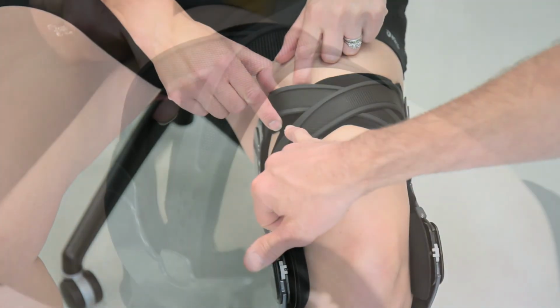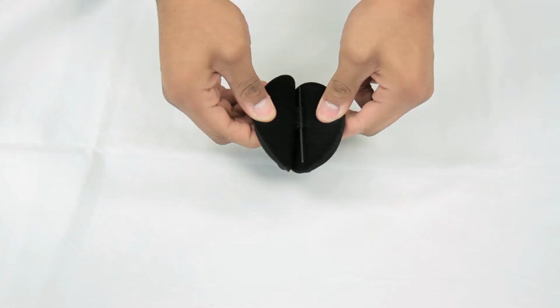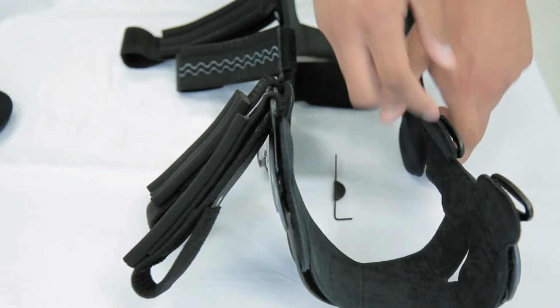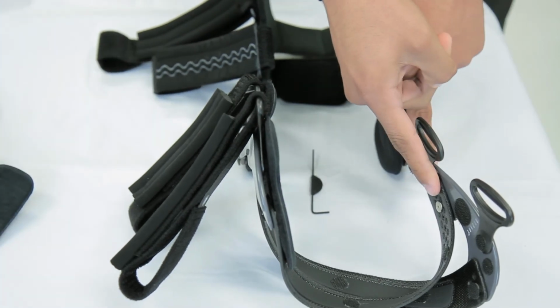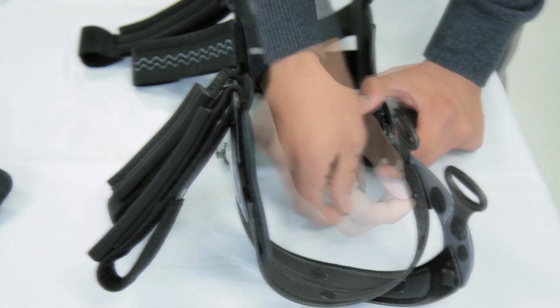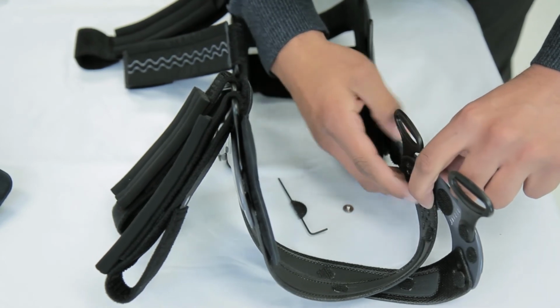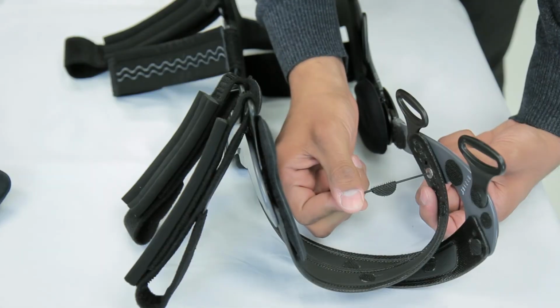Finally, take a look at the active thigh cuff, ATC. If the correction caused one of the straps of the ATC to buckle, you will need to tighten down the strap so that it lays flat. Locate the small Allen wrench in between the extra condyle pads in the accessories bag. Take the liners off of the brace. To access the screw, unscrew the bottom part of the loose strap. Pull the strap off the rivet and place it on the next hole to shorten its length. Replace the screw and tighten.